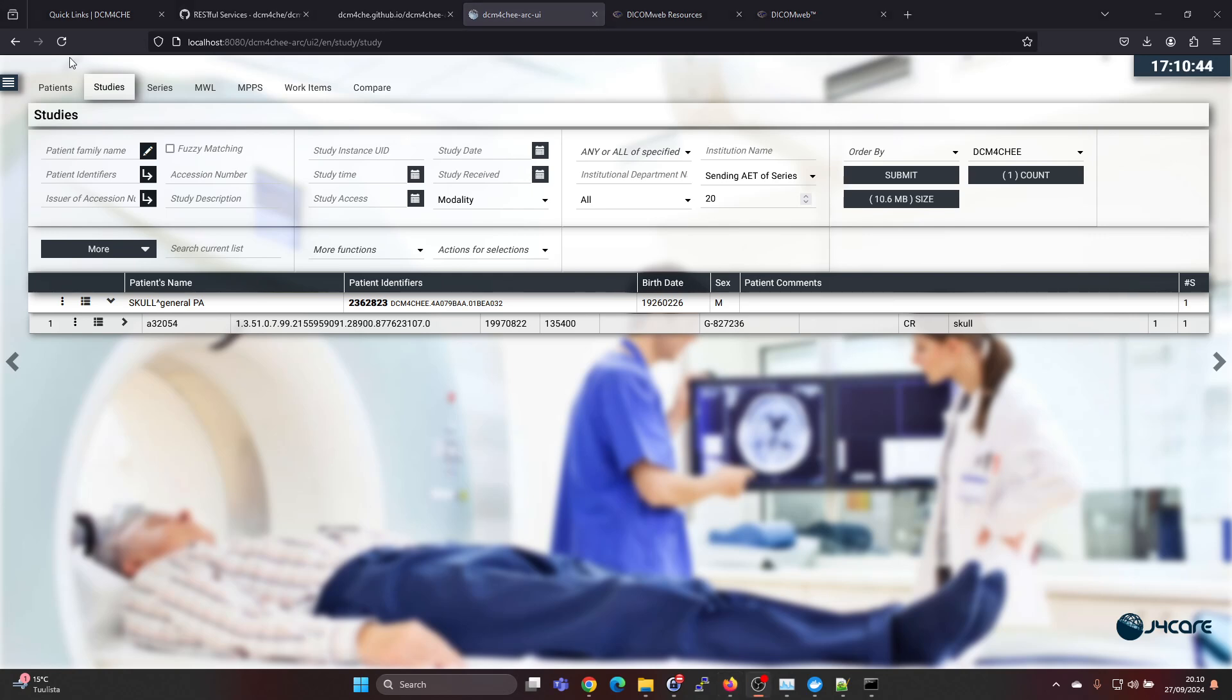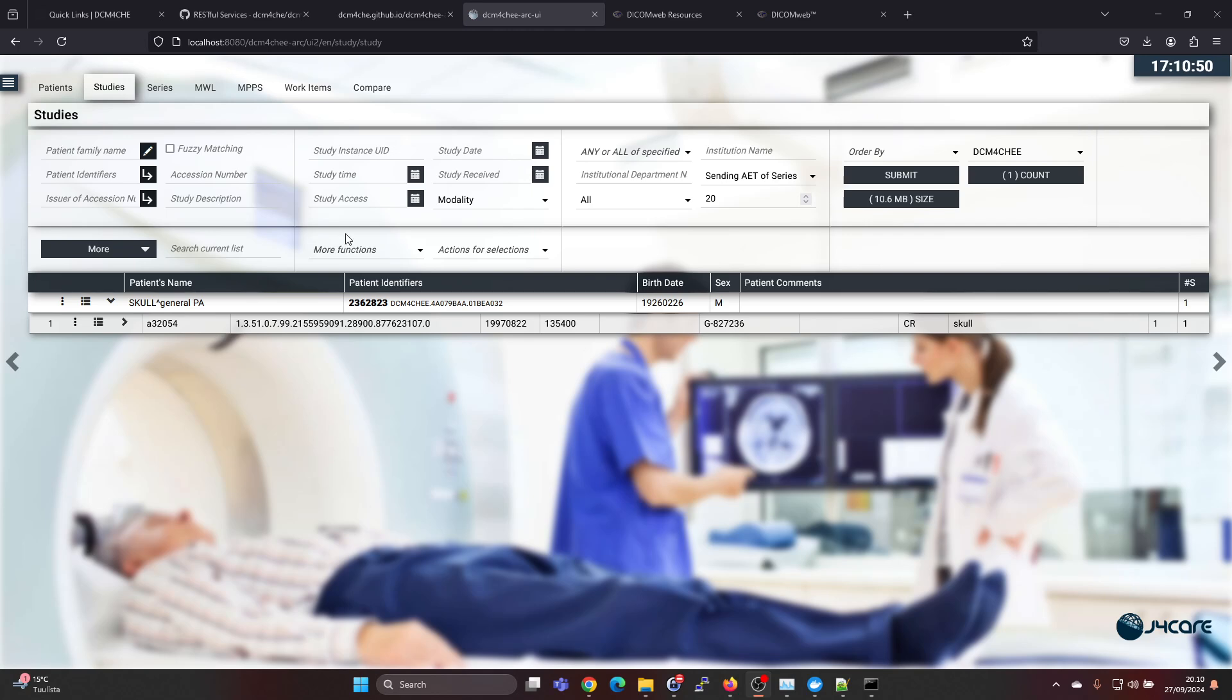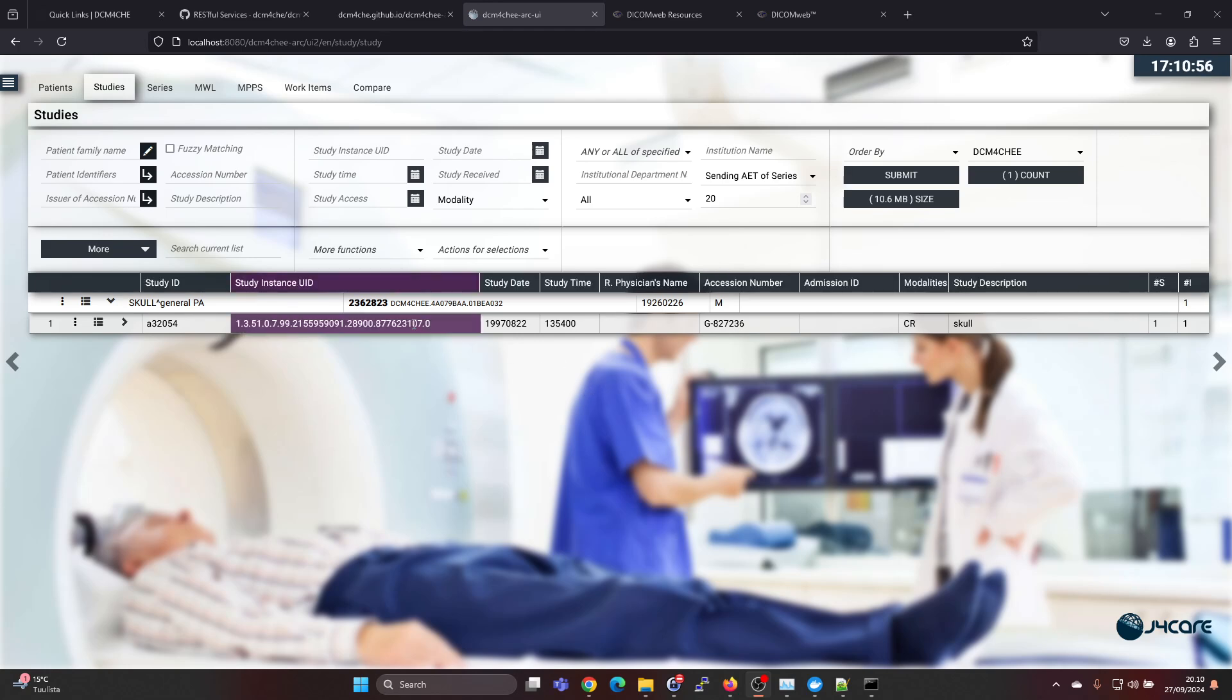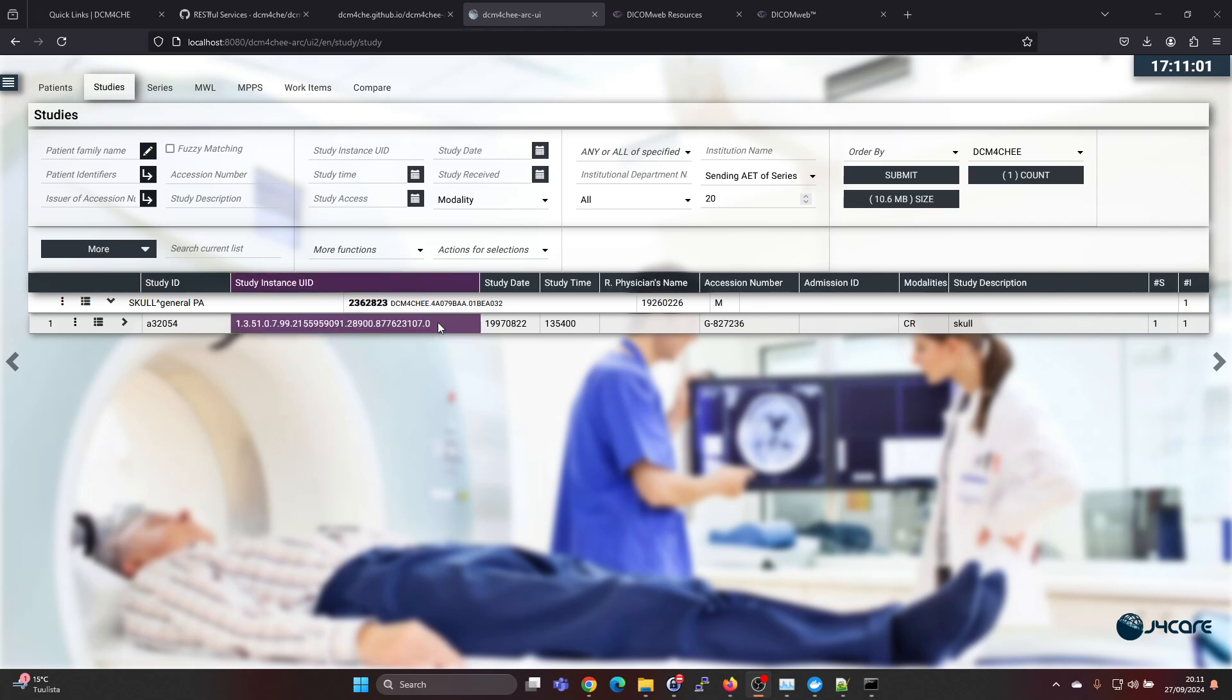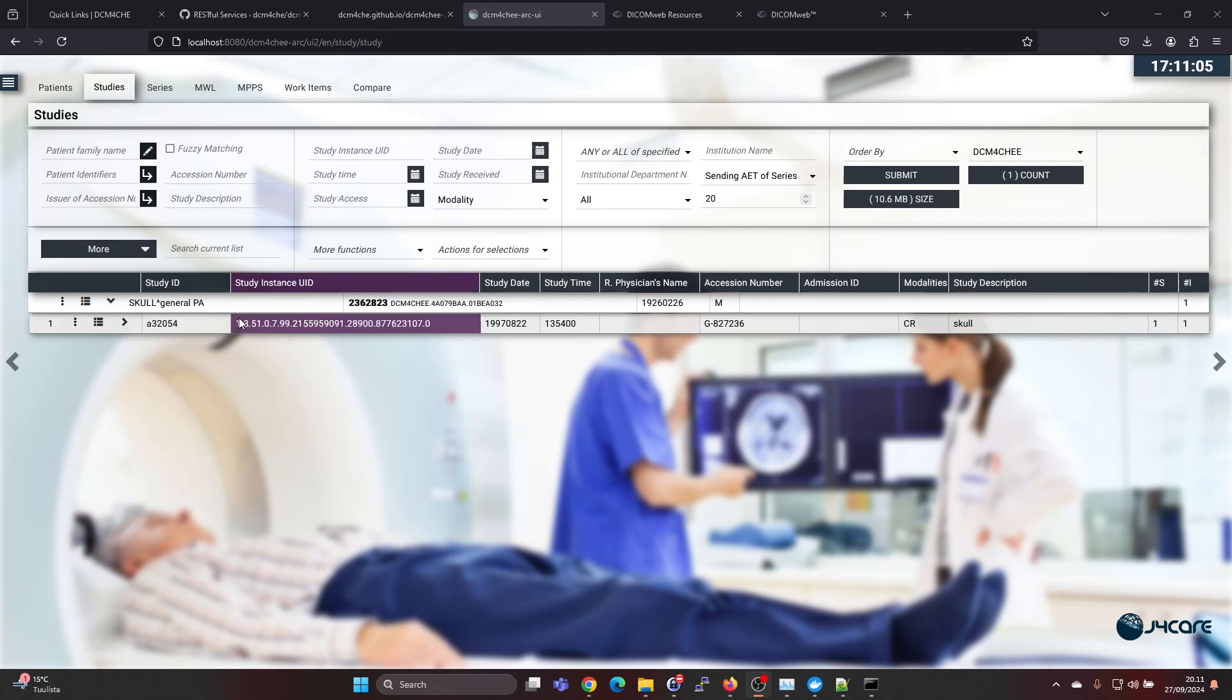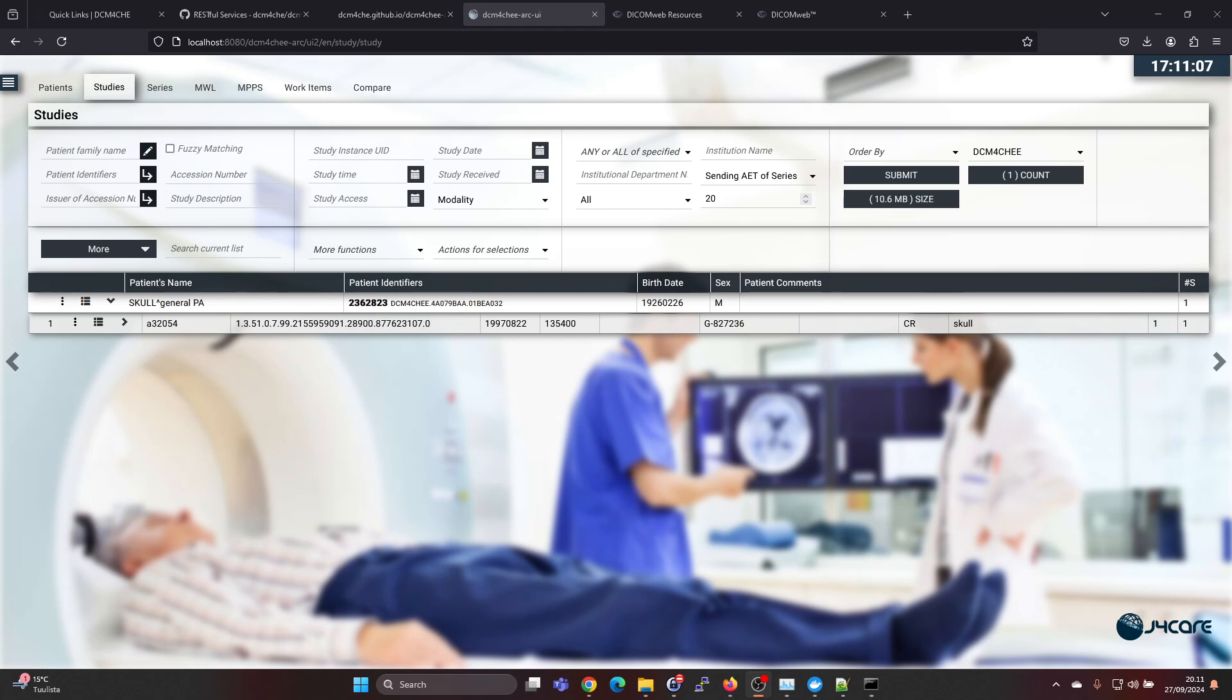Before we go to Postman, I'm just going to show you here in the Dicom4ChE UI that this is actually using the DicomWeb interfaces itself when it's accessing the backend. This is not doing a SQL query directly into the database but instead it's accessing it via the DicomWeb standard.